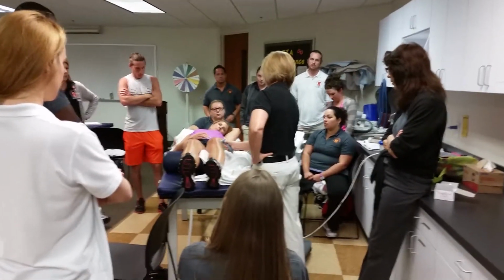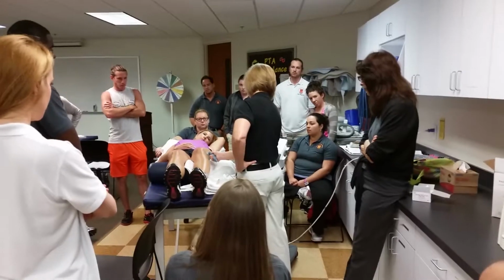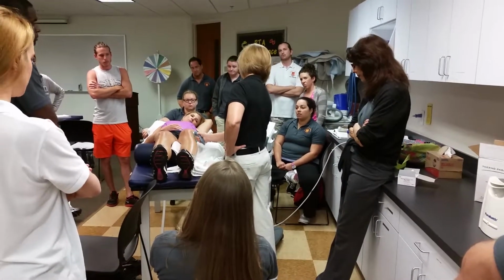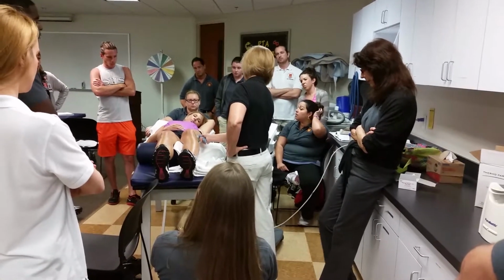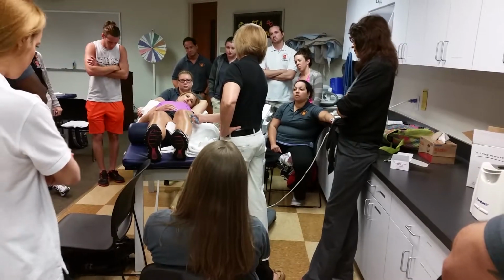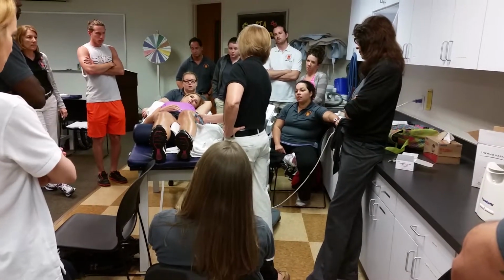You start at 0.7. Then you would stop now because she is feeling the heat. I would stop turning it up. I wouldn't turn it up anymore. As soon as she's feeling it, I'm getting what I want. I don't need to go any higher. Remember, we tickle, not hammer. We tickle tissues, we don't hammer them.